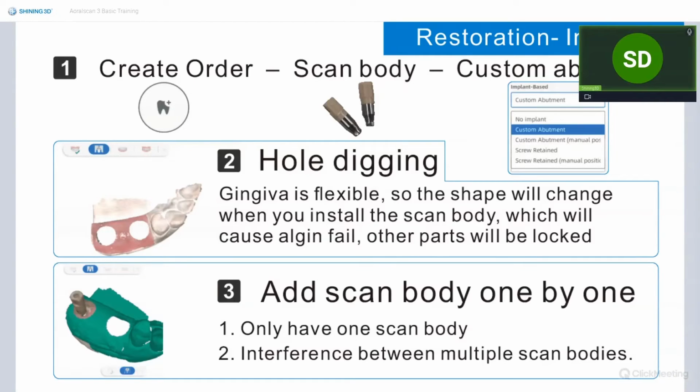How do you turn the scan sound on when scanning? The scanning sound is automatically on, that da da da da sound. Do you have a rapid scan function? We do not have something like rapid scans.